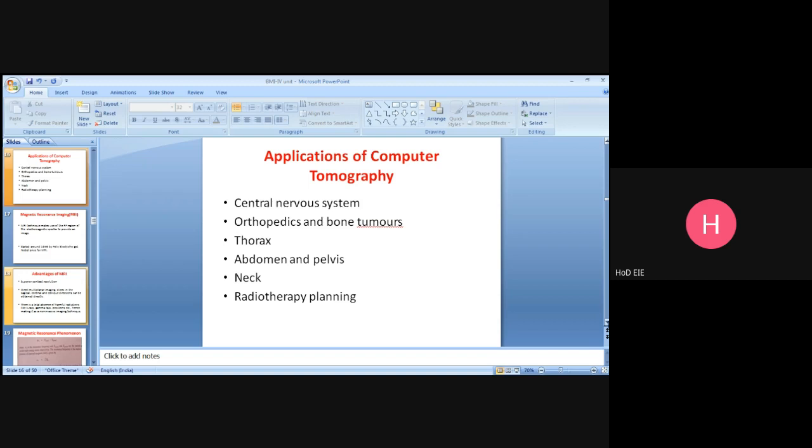So here you are also making use of another one, that is the CT stereotaxy. That's one more new technique which is being introduced here. Mainly they are useful in finding brain injuries as well as vascular lesions, as well as in oncology, and it's used for primary malignant lesions. It is also useful in finding degenerative diseases.